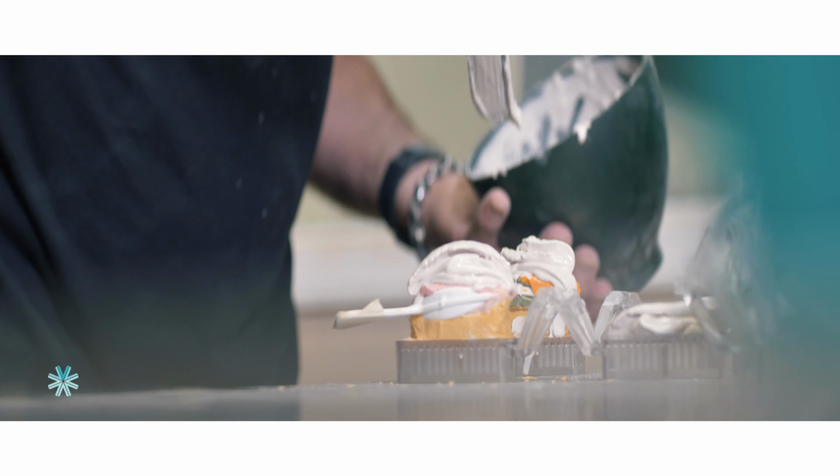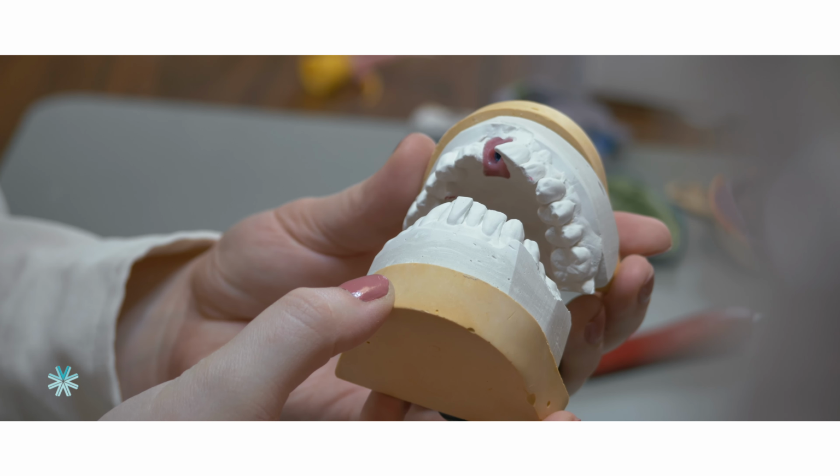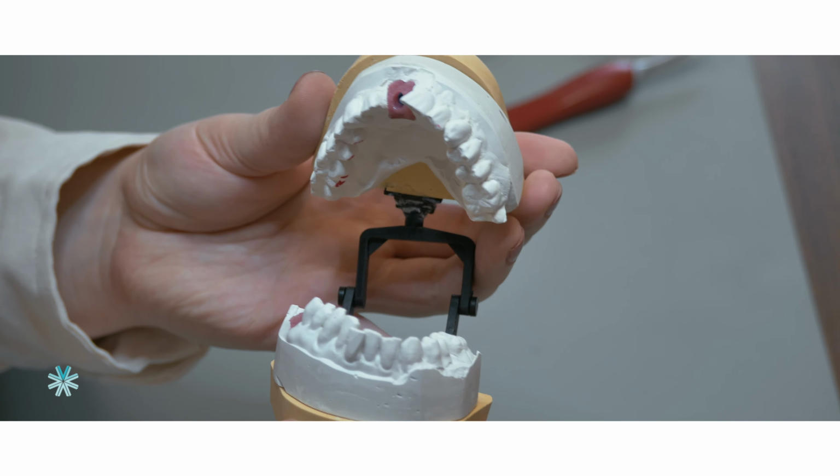This is what we're left with, a stone model with a lab analog in place. So that's mimicking the implant in the patient's mouth. And we'll be able to scan that in and have that as a reference for our digital design team.